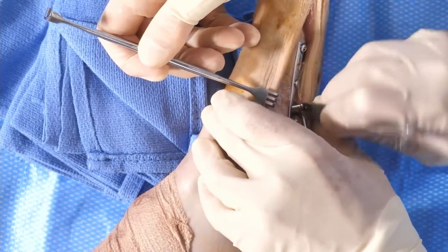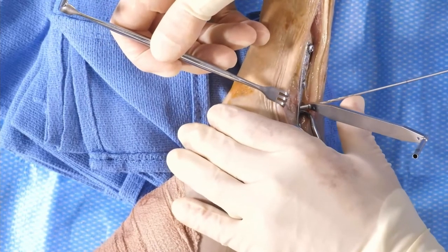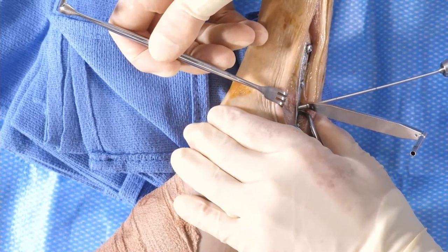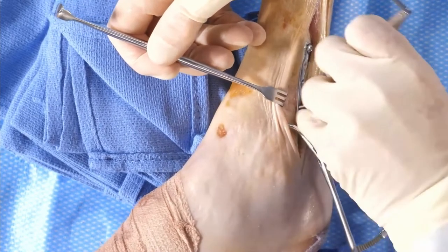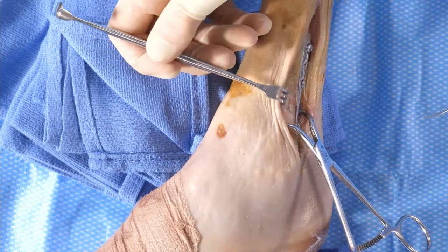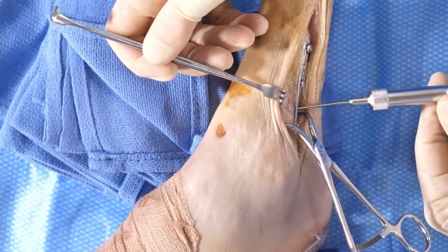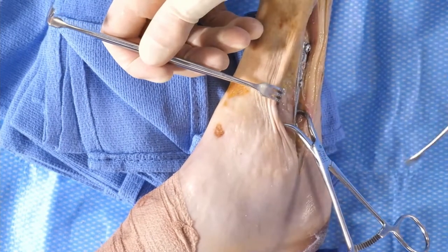So I like to use the simple little F benders that come on, I think they come on the small frag set. There's a typical ridge on the posterolateral aspect of the fibula. It's very posterior distal, and as you come up, it becomes more anterior as you come up the bone. So that's the contour that you need to accomplish.